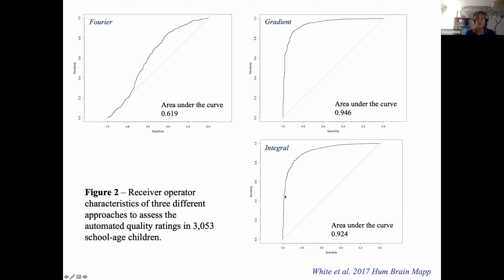This is the receiver operating characteristics of how well it can identify based on a different gradient. So you can choose a different gradient, and then you can have a high specificity or a high sensitivity. No, computing ROC still requires labels for each image, and the feature extraction has to be performed on scans that were acquired prior to repeating, right? That's the whole point. You want to detect if the scan was bad based on the original scan and not the repeat. Oh, right. Yes. So it was based on the original scan. Okay, cool. That's a good point.